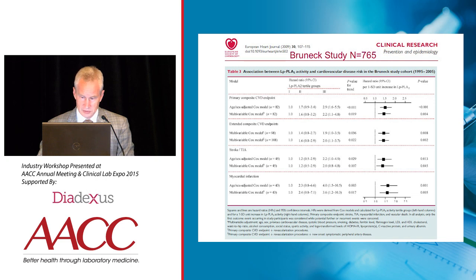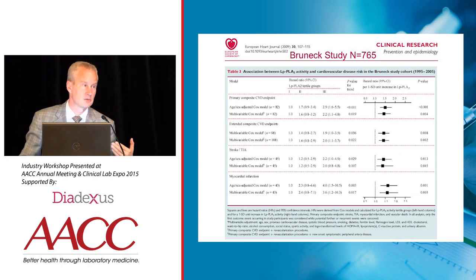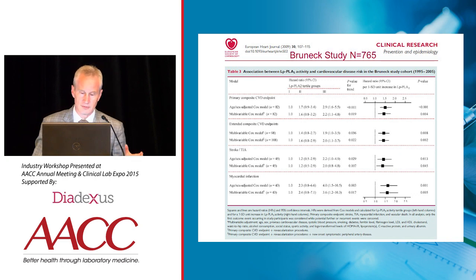And you can see the internal consistency. This is per 1 standard deviation unit increase in Lp-PLA2. So you can look at the precision in risk prediction of the activity assay. It's really remarkable in terms of what a signal you're given with this assay and cardiovascular risk.